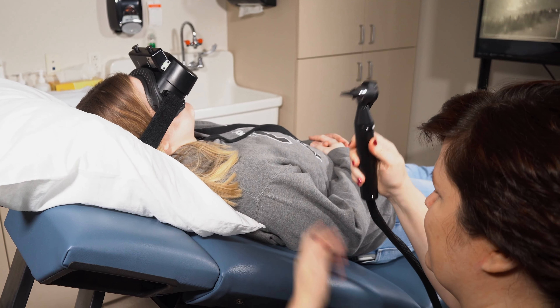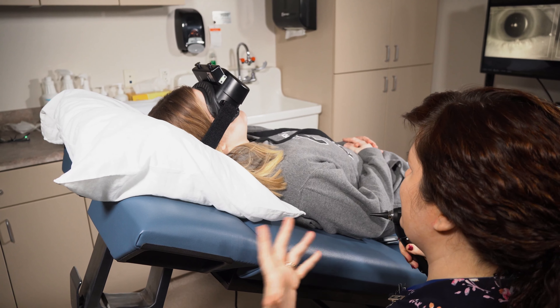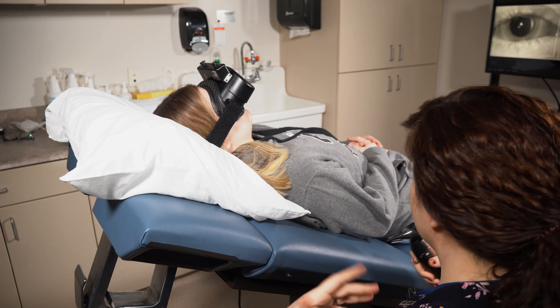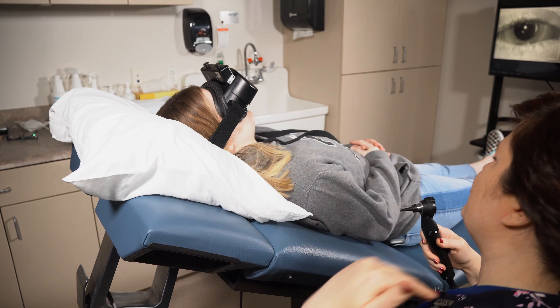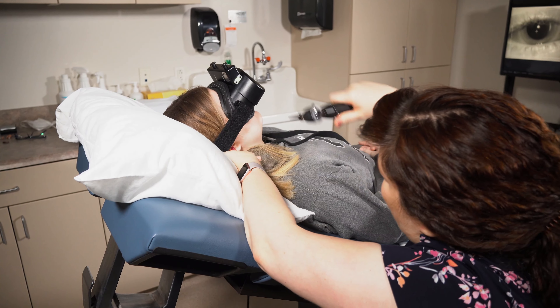It's a little bit loud, but with the head at this angle, when I cool down her ear with just a stream of air it will make her feel like she's spinning away from me. Then the effect wears off as her ear warms back up. Then we give her a little rest, do the other ear, give her a little rest, and then do each ear with warm air, which would make her feel like she's spinning towards me.